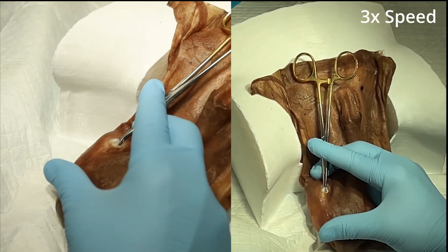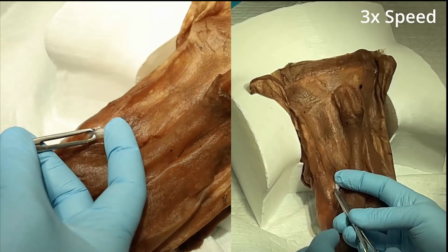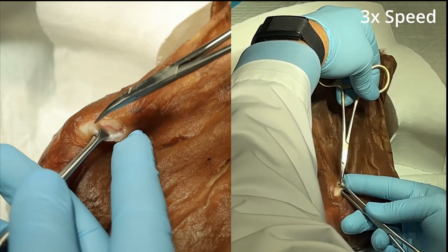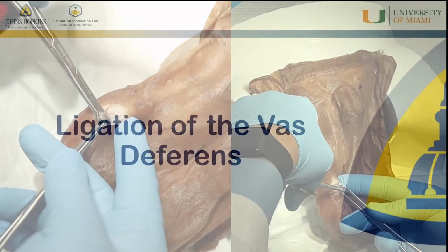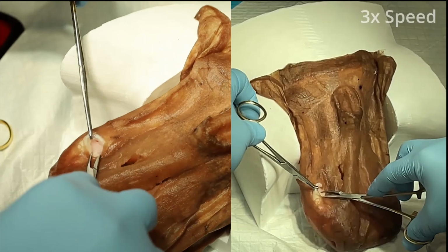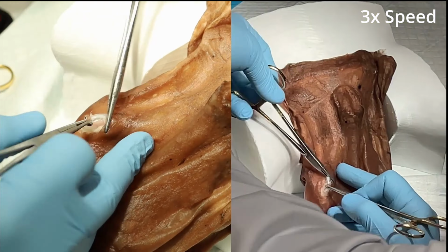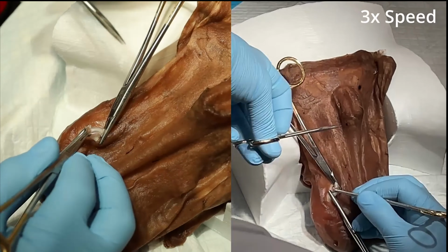All anatomical structures, such as the spermatic cord, could be palpated in each model, while procedurally irrelevant structures, such as the penis, were omitted to improve the transportability and manufacturing requirements of the model. The hydrogel nature of this model ultimately allows the surgeon to fulgurate, cauterize, and/or tie the vas, completing the full procedure as in live surgery.